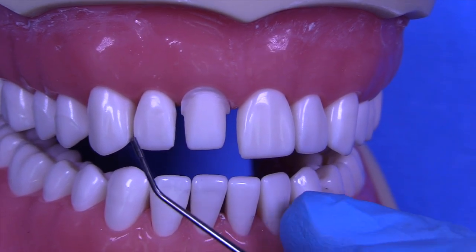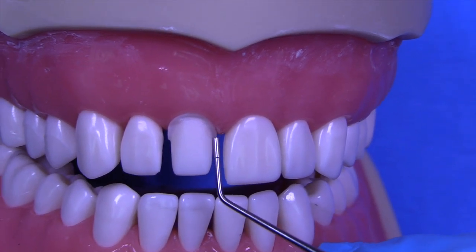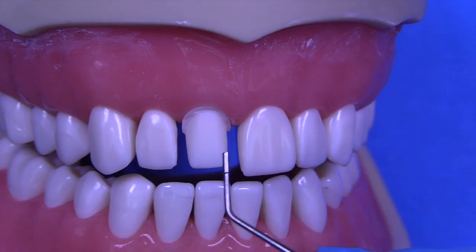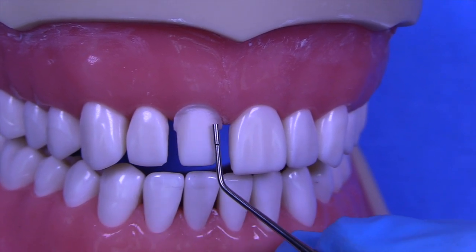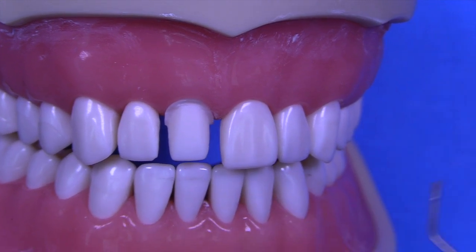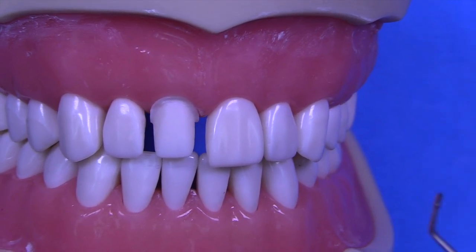When we look at the taper, I see no undercuts, looks good, but when I look at it from the facial, I don't see enough shoulder. I see shoulder that's probably just barely a millimeter over here, and it's definitely less than a millimeter here. One of the keys to success on a PFM is to see a 1 millimeter shoulder from both the mesial and distal. That always will set you going in the right direction.